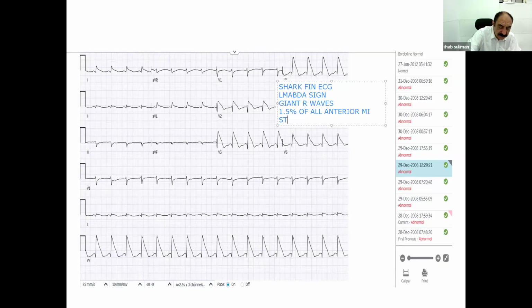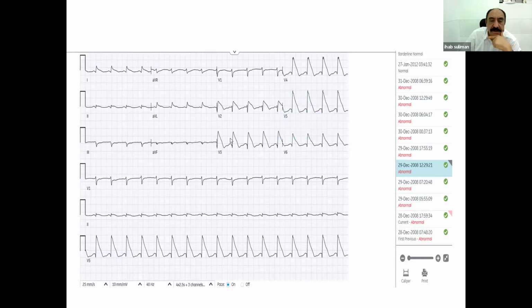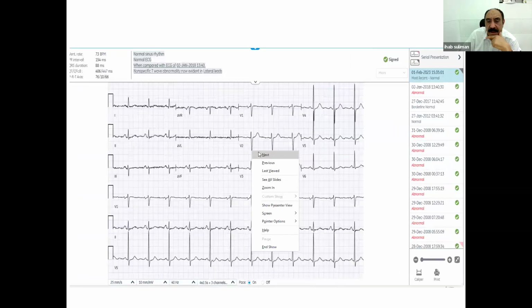It can occur with anterior STEMI or can occur with stress cardiomyopathy. Because the patient usually will be very, very sick, and he might go easily into arrhythmia or into cardiogenic shock. So by this, my colleagues, I come to the conclusion for these scenarios of ST segment elevation.